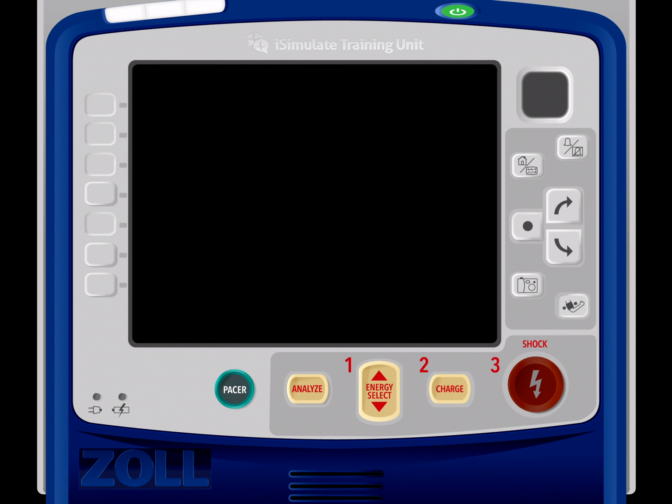And the big thing with the dynamic cardiology, aside from knowing the appropriate care, knowing the appropriate energy to deliver, is never letting there be gaps in CPR while that's going on. You always have to make sure you're verbalizing. We're pausing for a rhythm check. The rhythm is X. We're back on compressions while we're charging the monitor. Once we clear the patient to defibrillate, once the defibrillation has been delivered, we're back on CPR immediately.